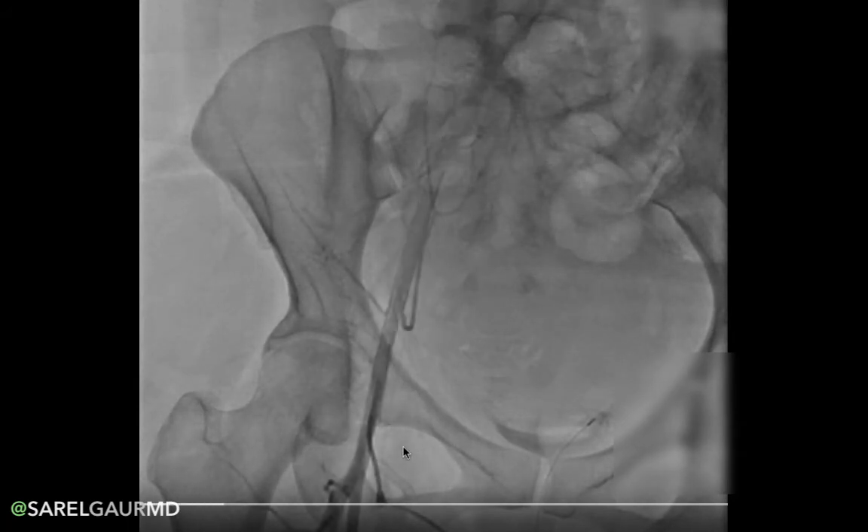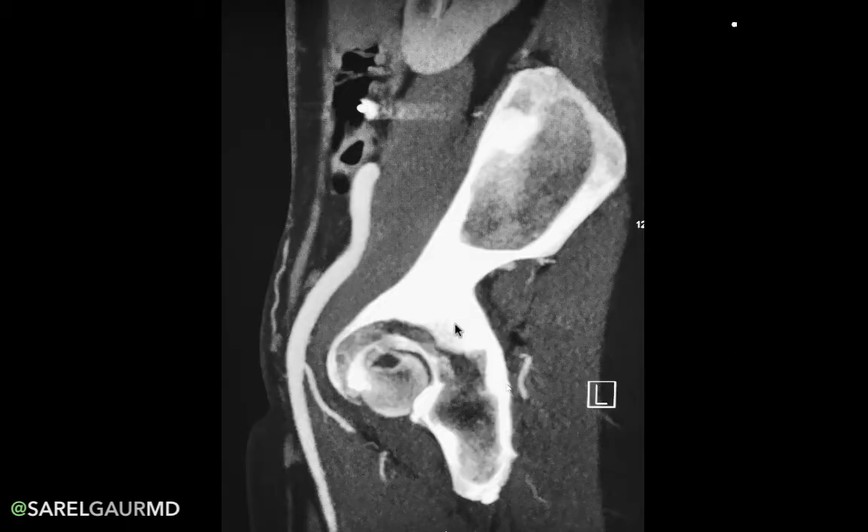Just to drive the point home, here I have a sagittal MIP image from a CTA. We can see the external iliac artery turning into the common femoral artery and its relationship to the femoral head. You can see that as we come through the skin, we have a good place to compress that vessel as we pull out the sheath. And if we access the external iliac artery deep in the pelvis, we do not have the ability to compress it against a bone — this is where you can get uncontrolled bleeding in the pelvis, a retroperitoneal hematoma, which could lead to death.